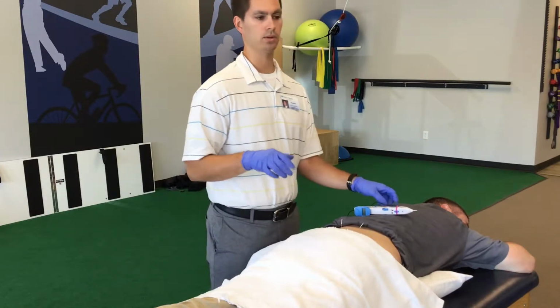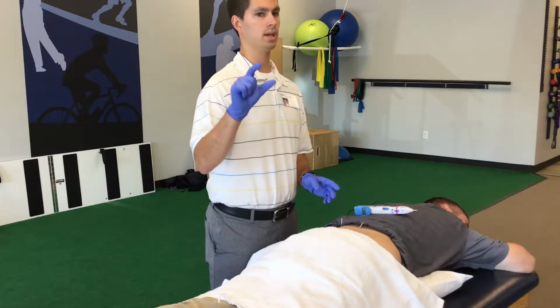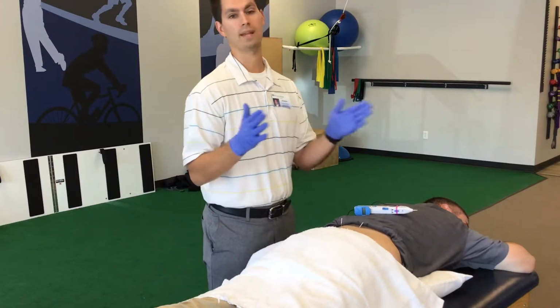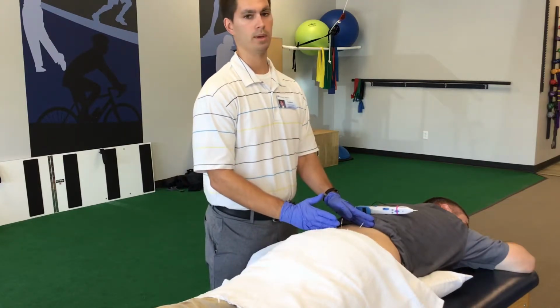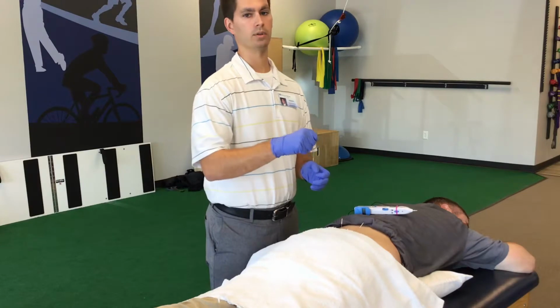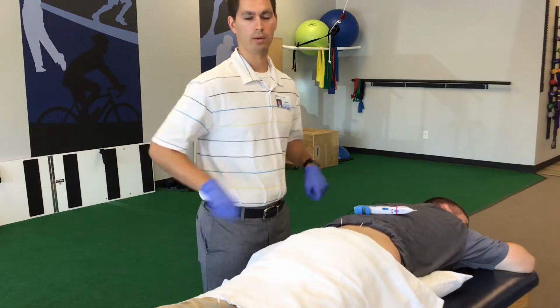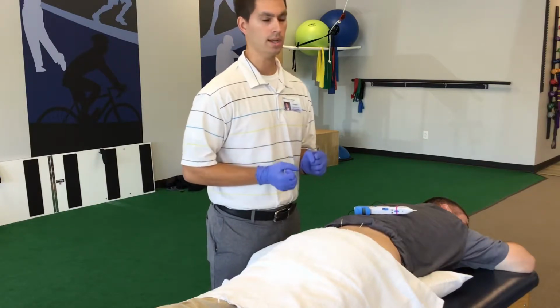And so what it does is it goes through all of the paraspinal muscles. There are some that run just from one segment to the other, some that run like 2 to 3 segments, some that run like 3 to 7. They originate down here, and they might insert all the way up here. But we poke through all of those. If you extend your back or arch your back and you feel on your back, those muscles that pop out next to your spine, those are the muscles that we're trying to get here.